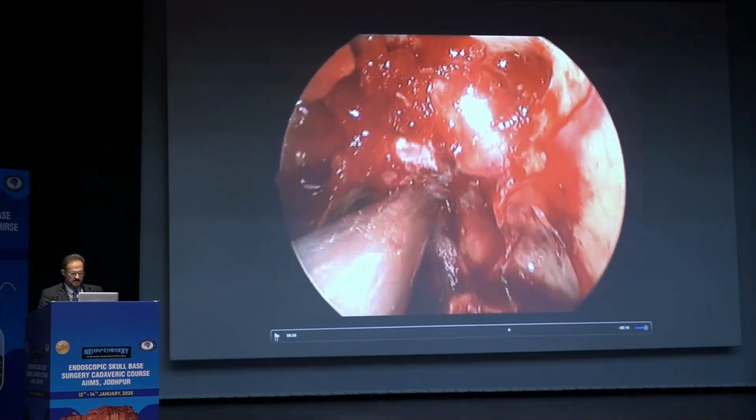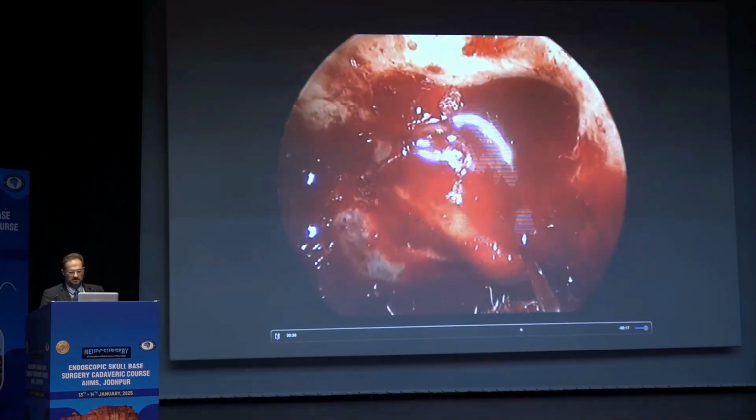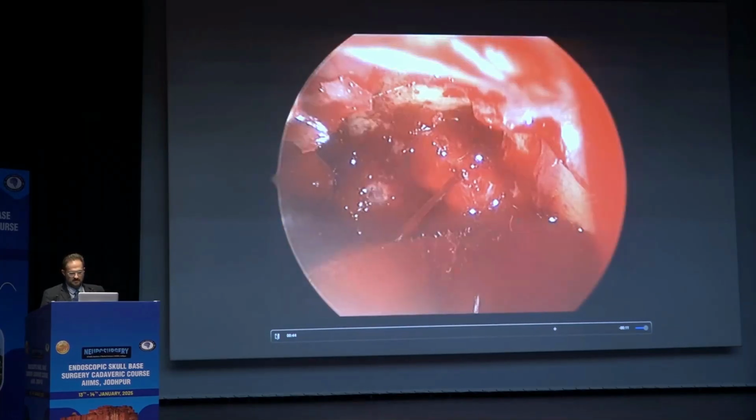So now you can see the anatomy. The sella is down here, and the surgeon exposed here. See the carotid, see the optic, it's right there, the optic carotid recess, just for orientation. But this surgeon was thinking that this was the sella because he covered up and got disoriented. He said, oh, it's a little interesting sella, but let's open, let's get the tumor out. And decided to open right there.